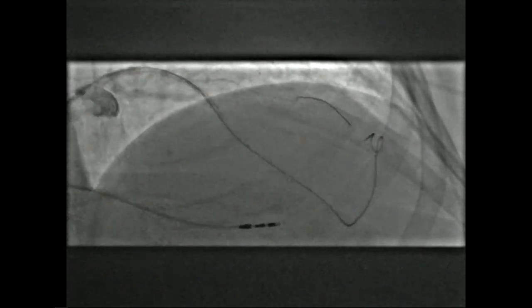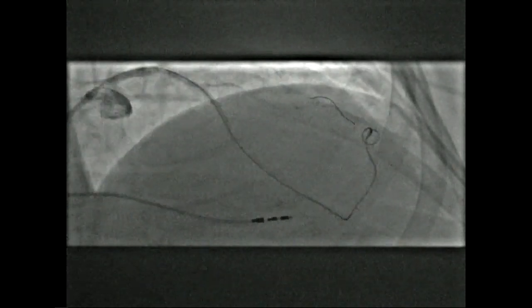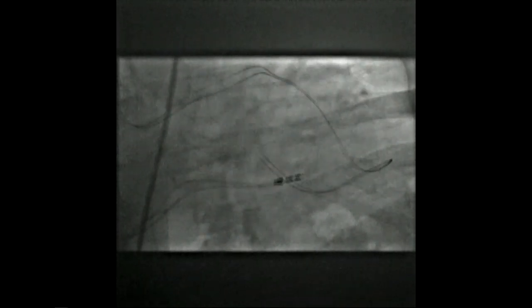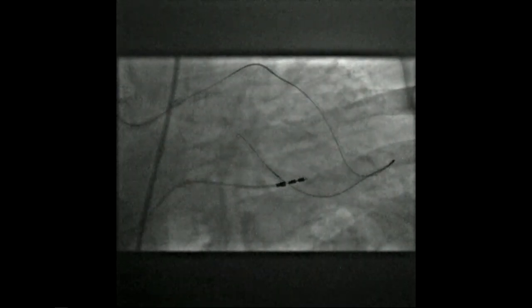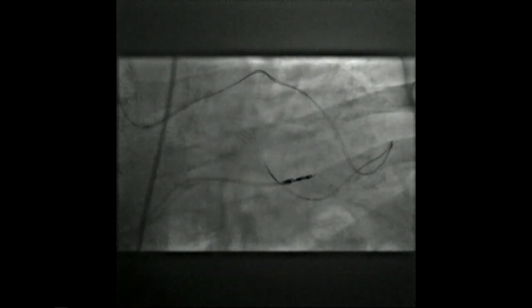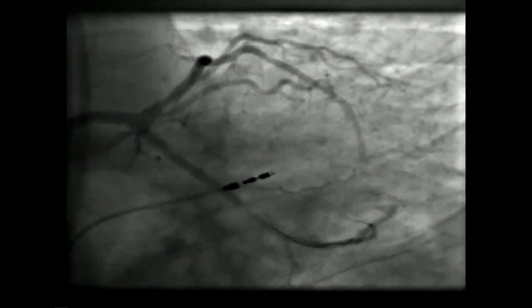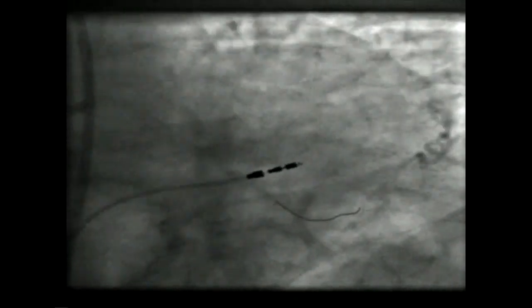This is a Turnpike LP — you can see all the tortuosity it can take fairly nicely, and occasionally once you bring it through there, it straightens out. Some of that tortuosity can be a little scary sometimes, but usually you have to really gently torque the catheters as you go through to decrease the resistance, and then it allows your wire to go all the way up through the cap and finish the case. On this case we wired both directions just in case we had trouble, but there was no issue.